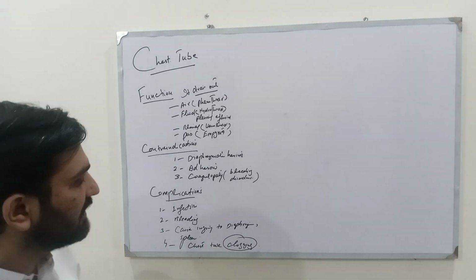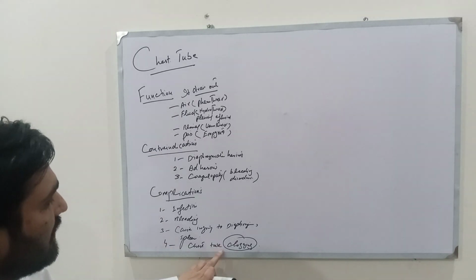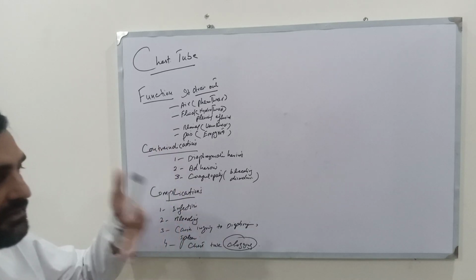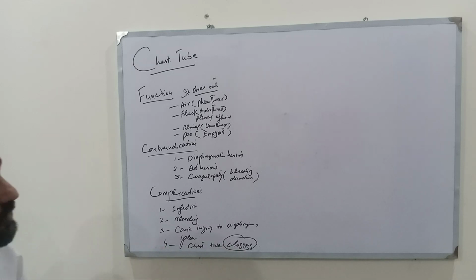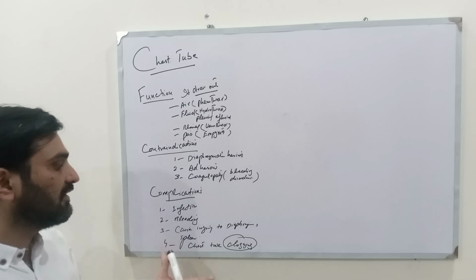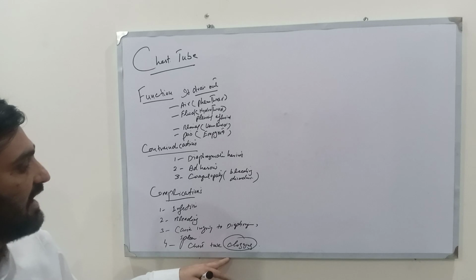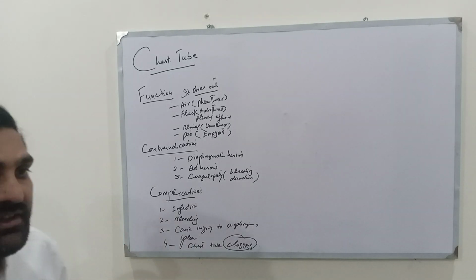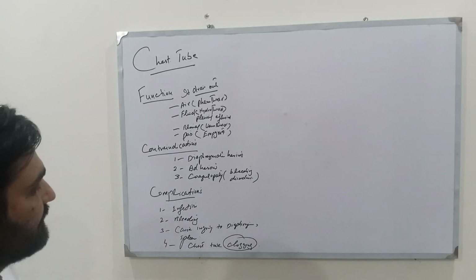It means there is a blockage of chest tube due to any cause, or maybe there is a stoppage of normal activity, normal passage of chest tube, which leads to clogging of chest tube and complications. It can lead to bleeding around the heart and lungs, and leads to hematoma formation, which again needs to be drained out, otherwise can lead to deleterious effects.